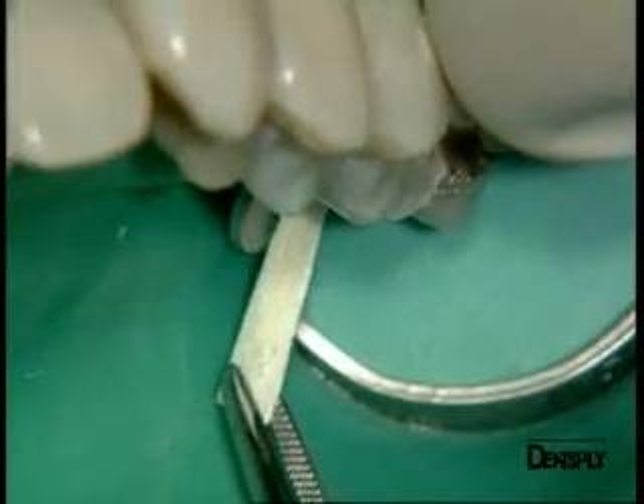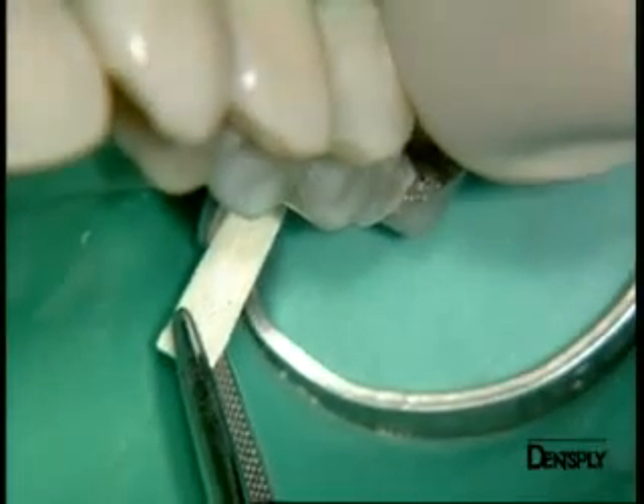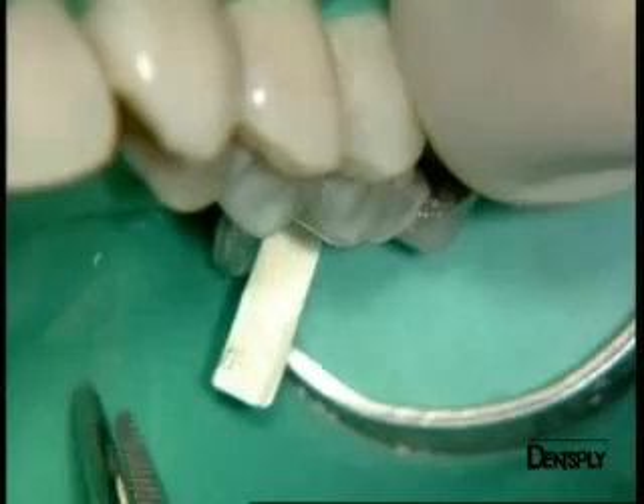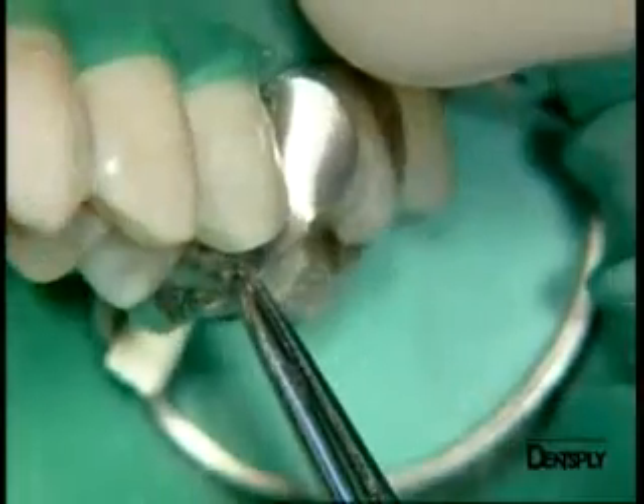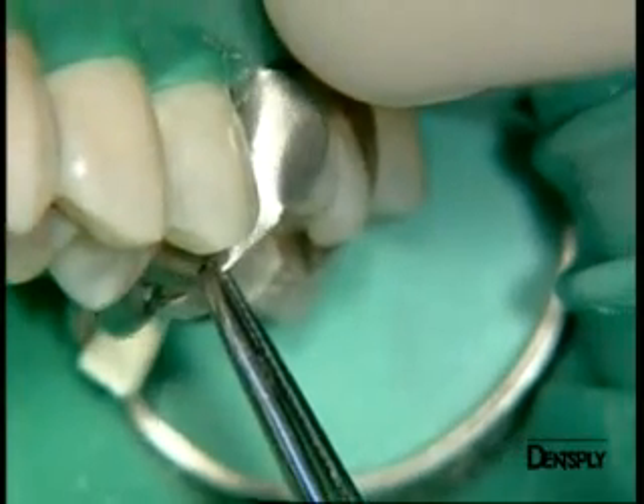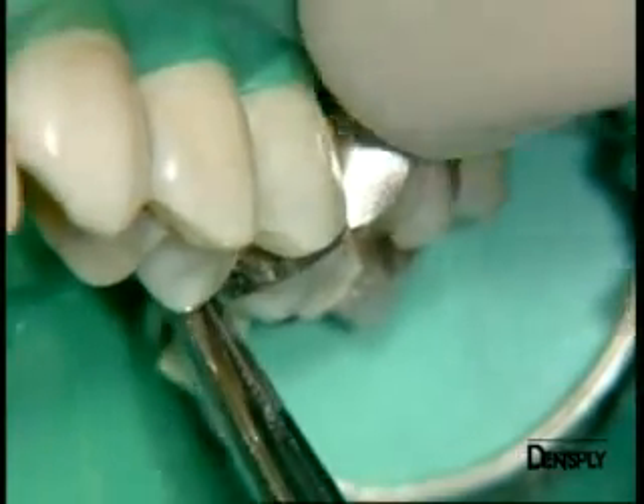We insert a wooden wedge to ensure a perfect fit, this wedge being forced into the interproximal space. The Paladin matrix band is also inserted mesially, as you can see, followed by the wooden wedge.